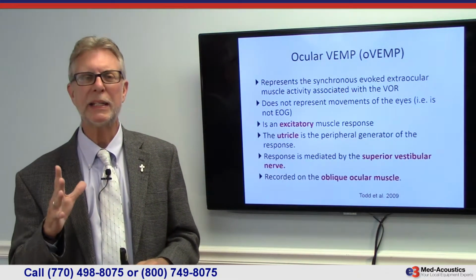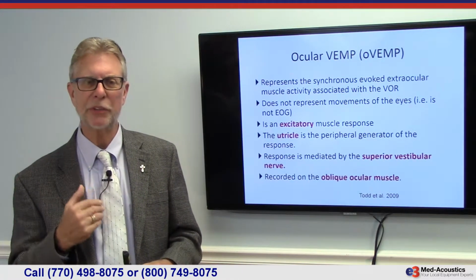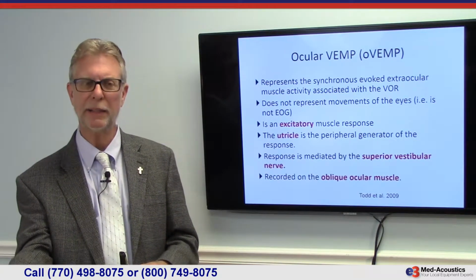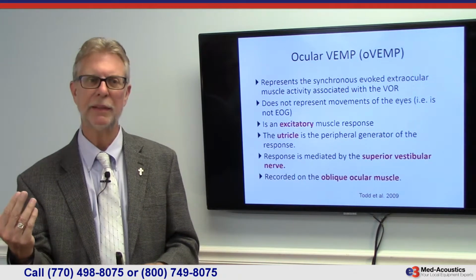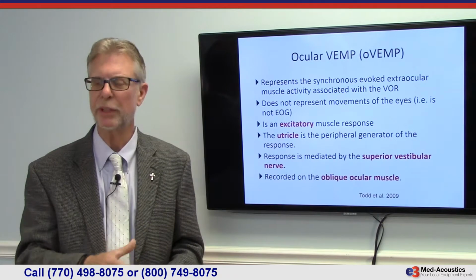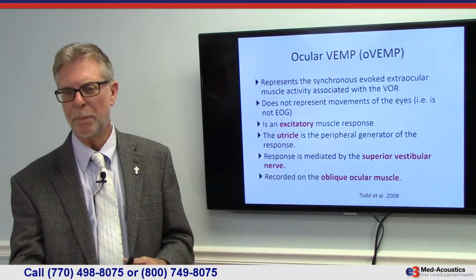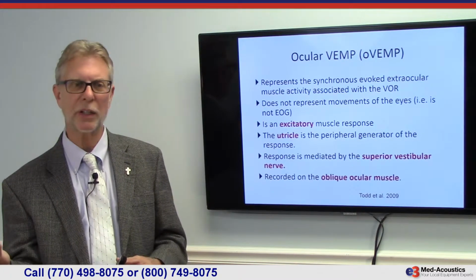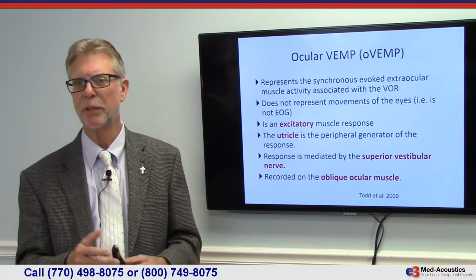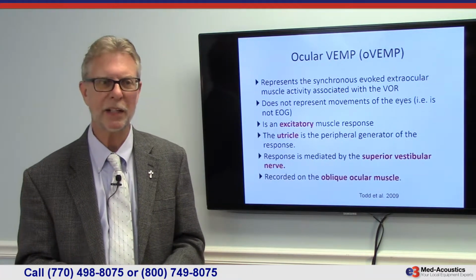And it might be contraindicated with people that are not able to do the task. I have them lying down flat and supine, and then raising their head 3 or 4 inches and then turning 90 degrees. If that's not possible, what I do is adjust the exam table into the caloric position. So now the back of the patient is raised up 30 degrees, and sometimes that makes it easier. If they can't do that, then it might be contraindicated.